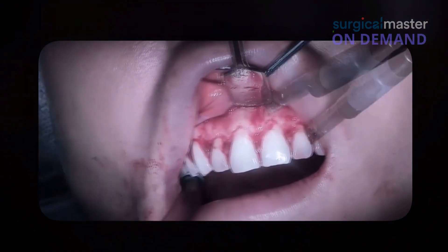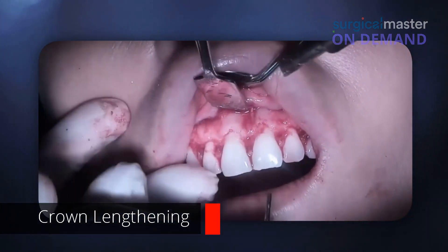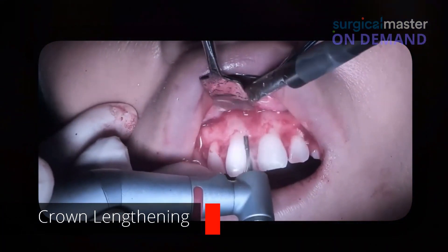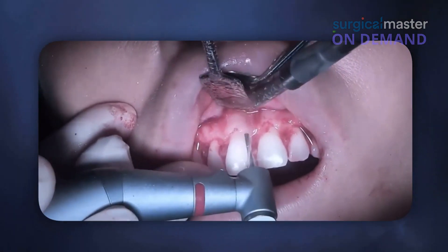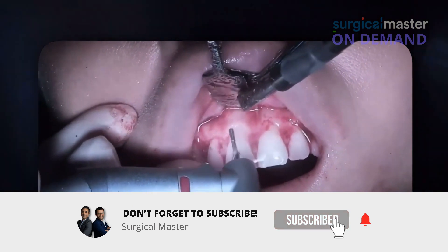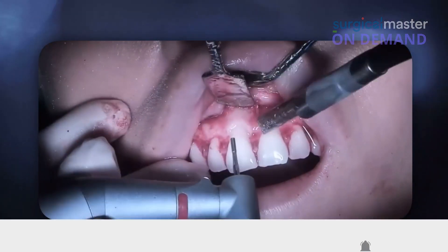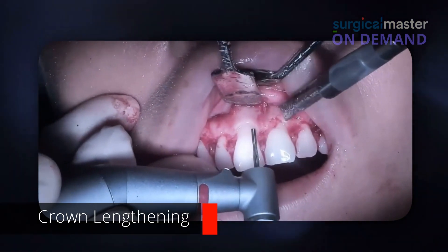It makes me want to do a crown lengthening — okay, so here it is, here's the crown lengthening. Here's the first drill, this is our end-cutting drill. Full gas on the pedal. You can see I'm just reducing the height, cutting from the sides, just the tip.